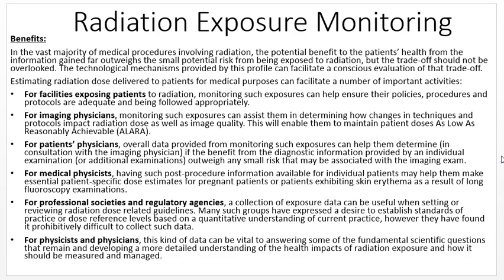Radiation exposure monitoring for the patient is a hot topic in healthcare now. New legislation was passed last year that takes effect in July 17 that states every CT report must include the patient radiation dose. The days when the patient could have all the radiation they wanted are probably coming to an end. Patient radiation exposure will be something that has to be measured and managed by the patient's primary care physician.